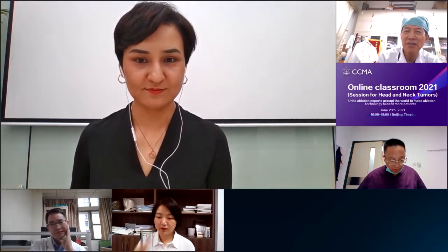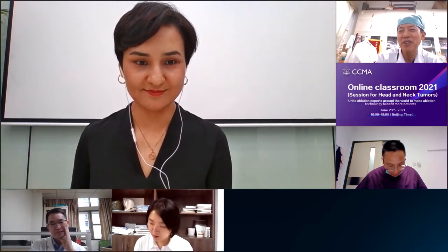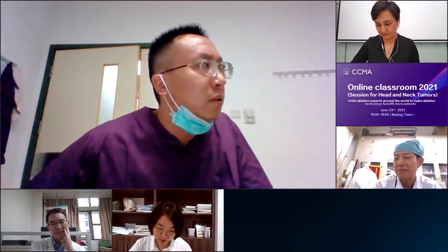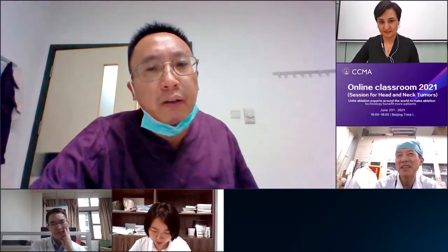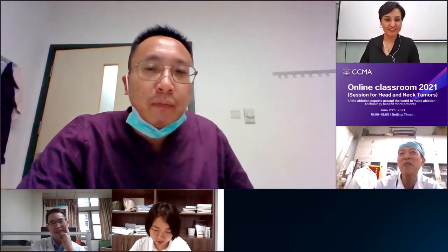Okay. So I think it's easier to answer for all doctors. Please, who would like to give the comment? How to control the volume of the lidocaine during the procedure? Less than 15 milliliters. 15 or 50? 15. Okay, not 50. Be careful.